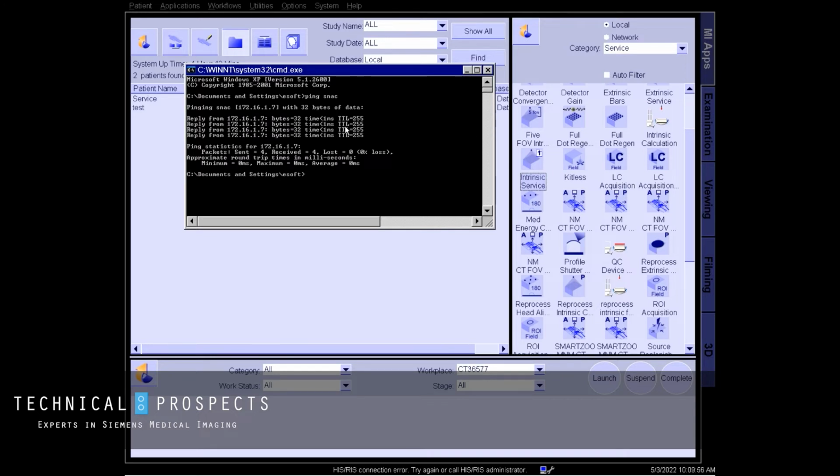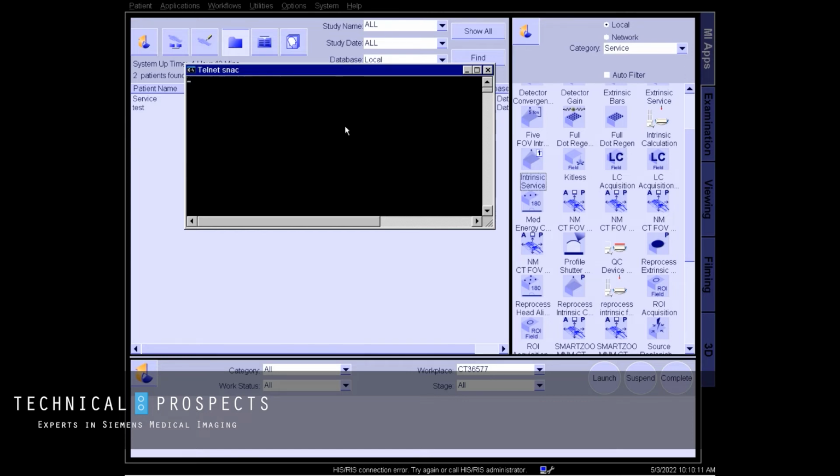On the other side of this, if we needed to force a reboot of the SNAC without getting into the other system, we can Telnet into the SNAC by typing telnet SNAC, returning. This will give us a login. We're typing all lowercase, service, and then the password is snacinside, S-N-A-C-I-N-S-I-D-E, all lowercase and no spaces. And now we're in service.